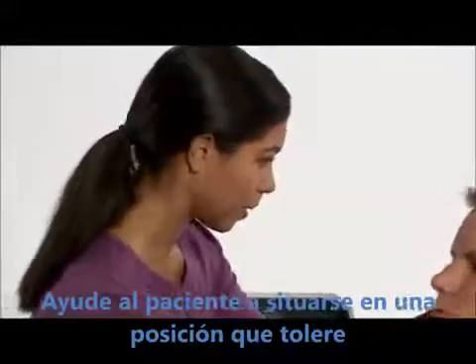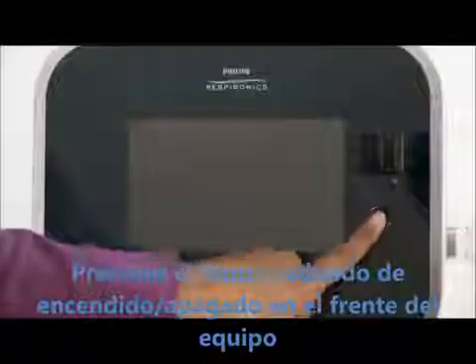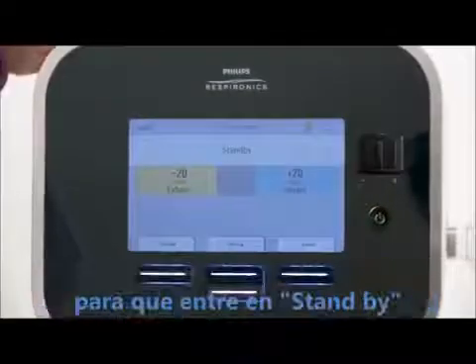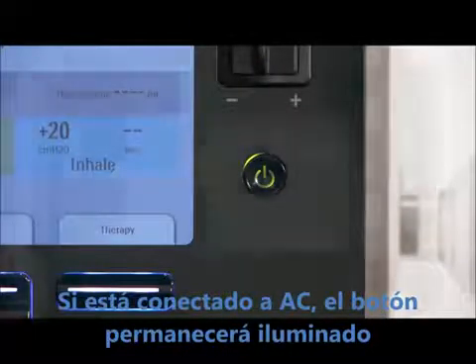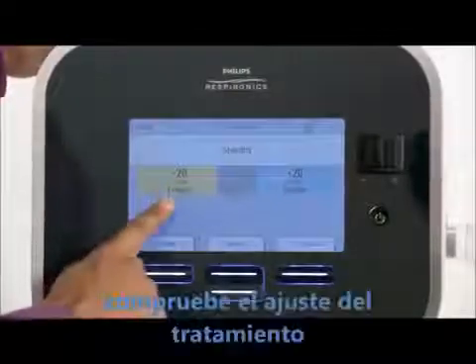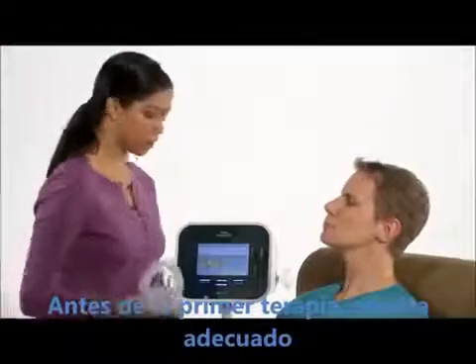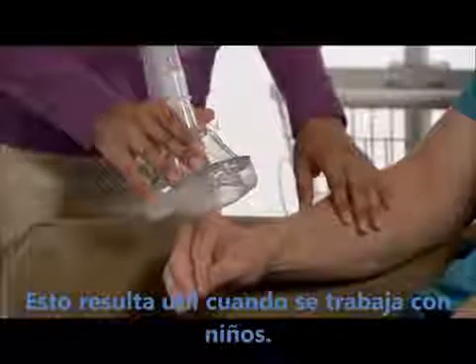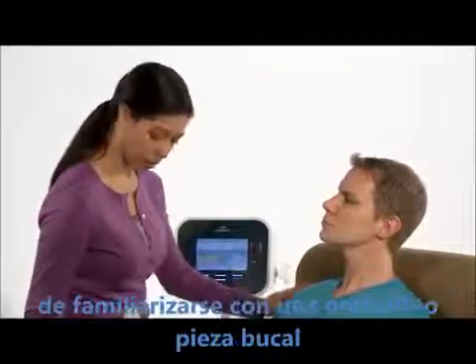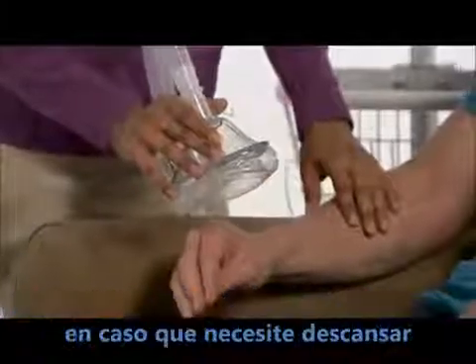Help the patient into as upright a position as he can tolerate. Press the round Start-Stop button on the front of the CoughAssist T70 to enter standby. If the device is running on AC power, the button will illuminate. Check the treatment settings to make sure they match the doctor's prescription. Before the first treatment session, it's a good idea to let the patient feel the airflow so he knows what to expect — this is especially helpful when working with children. Consider giving the patient an opportunity to get familiar with the mask or mouthpiece, and you may also want to work out a stop treatment signal in case he needs a break.